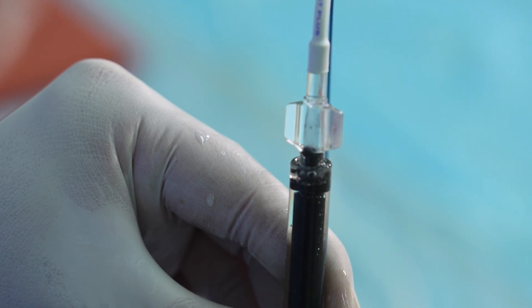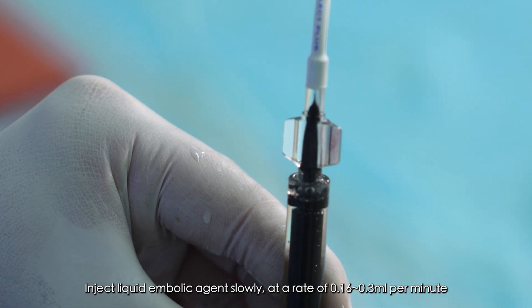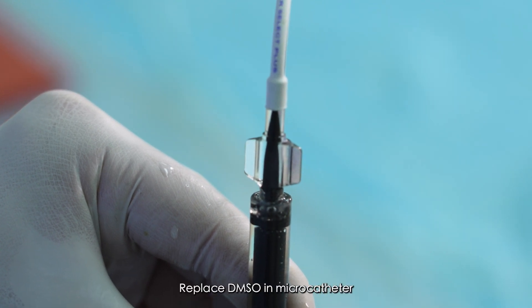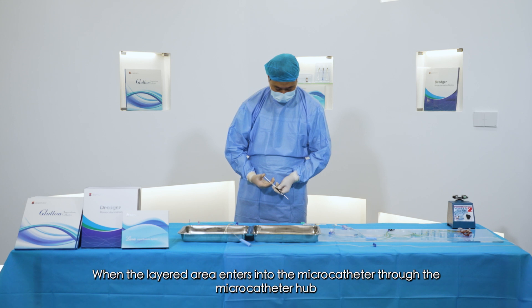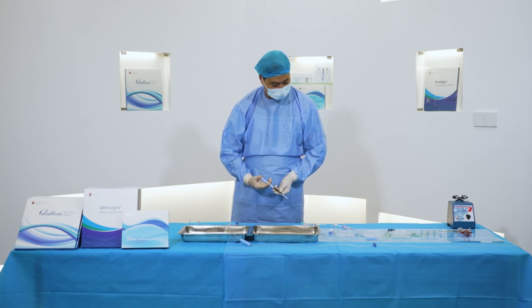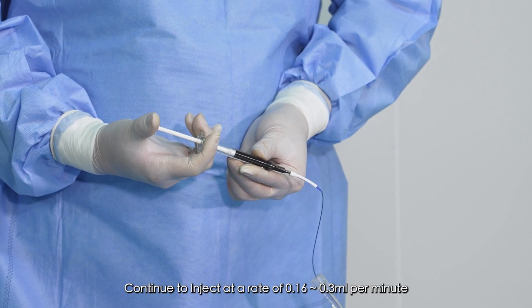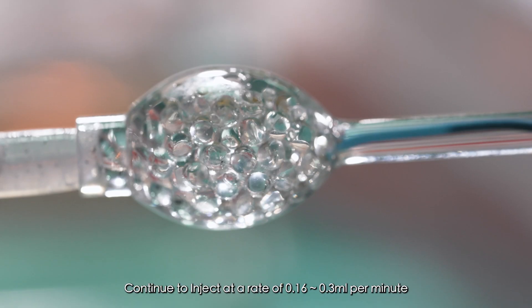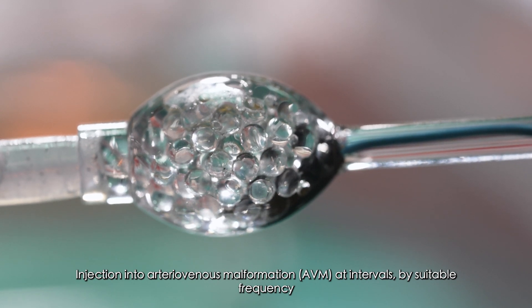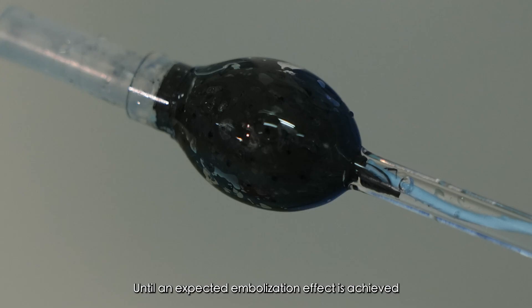Keep the syringe vertical. Inject the liquid embolic agent slowly at a rate of 0.16 to 0.3 mL per minute, replacing DMSO in the microcatheter. When the layered area enters into the microcatheter through the microcatheter hub, it can be changed to a comfortable position. Continue to inject at a rate of 0.16 to 0.3 mL per minute into the arteriovenous malformation at suitable intervals until the expected embolization effect is achieved.